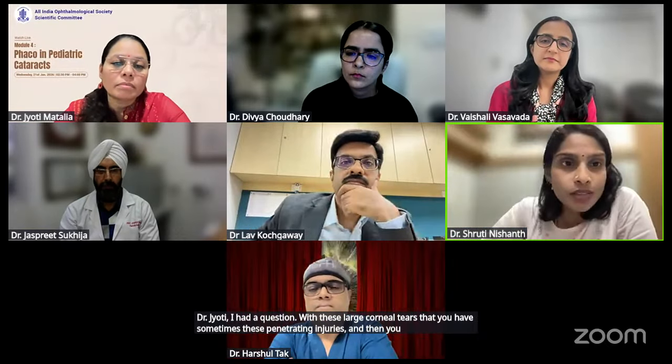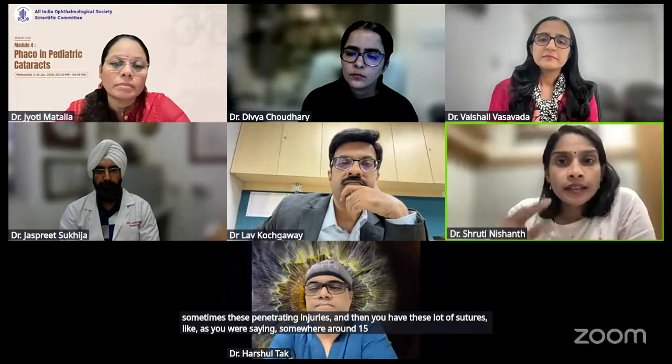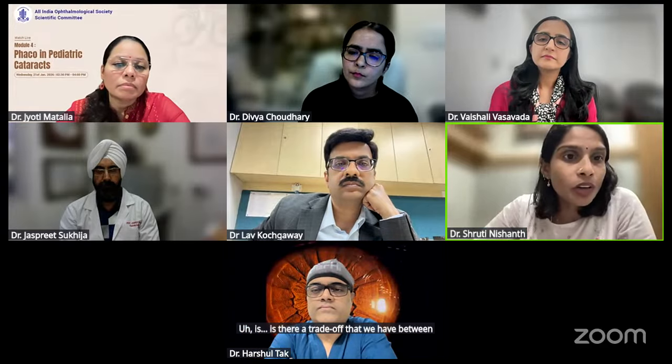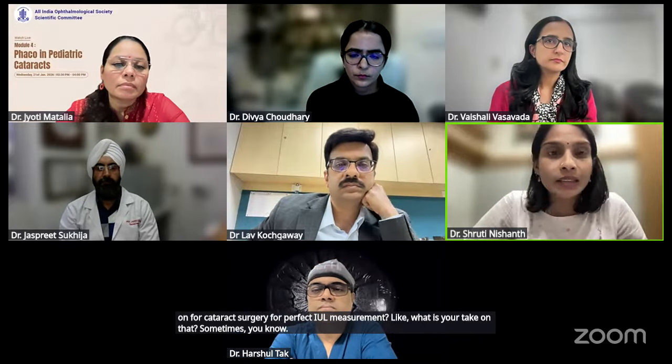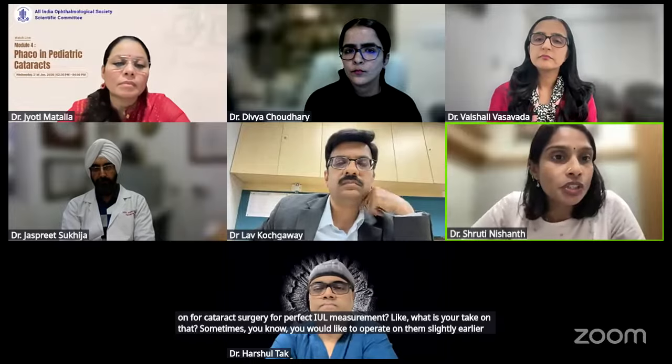Dr. Jyoti, I had a question. With these large corneal tears that you have, sometimes these penetrating injuries, and then you have a lot of sutures, like as you were saying, somewhere around 15 or so, and then you do these alternate removals. Is there a trade-off between amblyopia and holding on for cataract surgery for perfect IOL measurement? What is your take on that? Sometimes you would like to operate on them slightly earlier, especially in younger children.